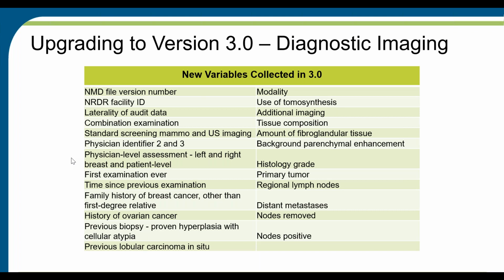If you're using NMD certified software, this is an option that you can configure when you first start using version 3 and leave it. You don't want to change this frequently because then your audit results would be derived from a mix of breast and patient level data, which wouldn't make any sense.